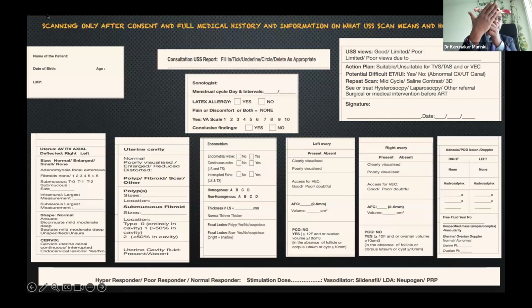So your best shot is to be in front of the uterus with your probe, or on the right side or left side. Of course, you can see certain things from the top, because it will give you the axial view. But if you're at the cervix, no ultrasound can traverse through the cervix to display any structure, so you're almost gone. So you need to try the anterior fornix, posterior fornix, right fornix, left fornix, bring the uterus down, do the Trendelenburg, anterior Trendelenburg positions, whatever it takes, right lateral, left lateral, empty the rectum, put saline in the vagina, everything possible to get the best black contrast against white ultrasound.